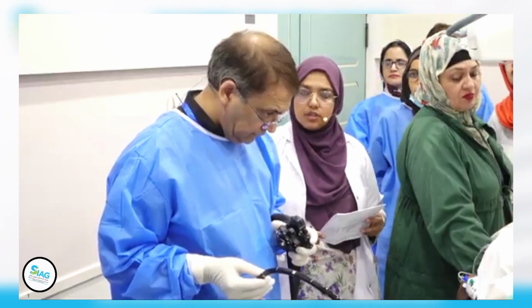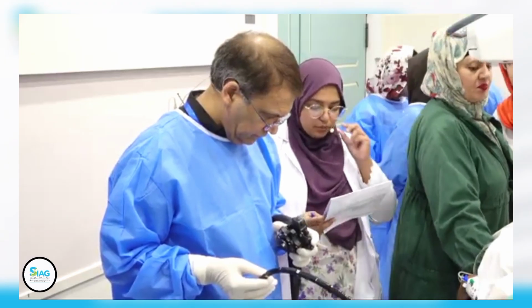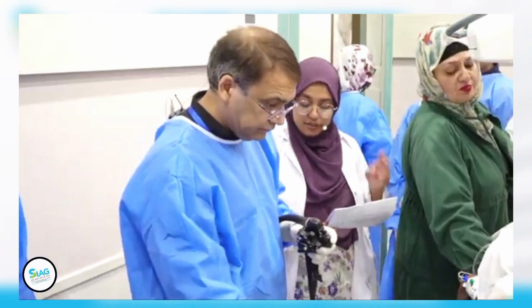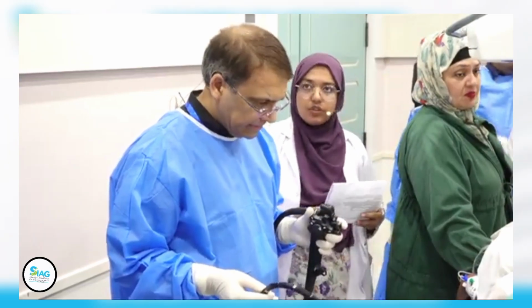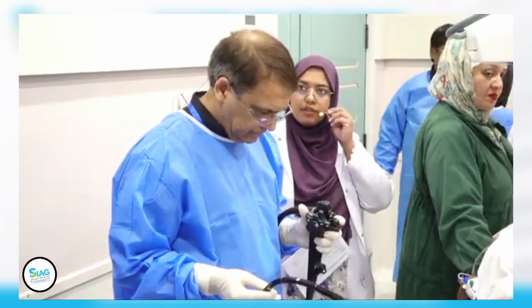At that time a CT was done which showed a pancreatic head mass measuring 2.4 by 2.6 centimeters with dilatation of the CBD and pancreatic duct, intrahepatic duct, sorry. ERCP was done on the 11th of August and we placed a CBD stent. Cholangiogram at that time showed a distal CBD stricture. Currently the patient is here for EUS plus FNB.